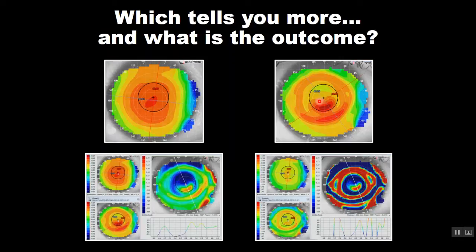So it's important that you use the subtractive map to make your final call, because one single map by itself doesn't give you 100% of what you need to understand what's happened. The subtractive map tells you how things are different. We look at the blue treatment zone here and say, well, it looks like it's positioning reasonably well. We look at the tangential map. It's decent, maybe a little bit low. So is it central island or smiley face?